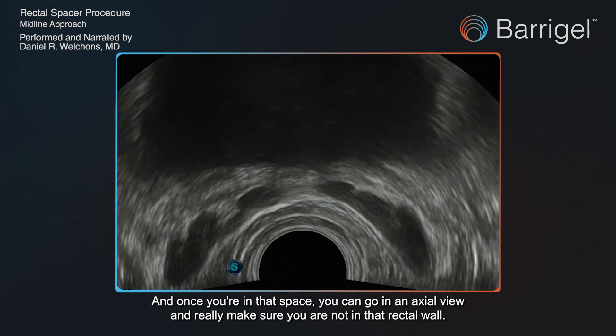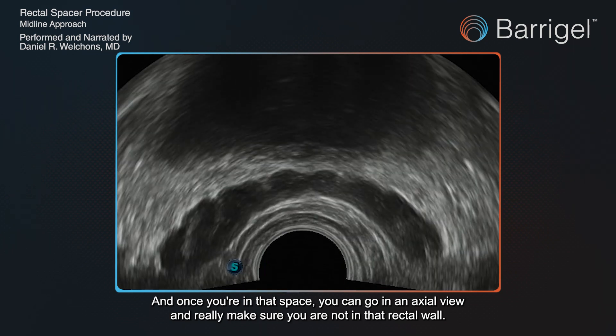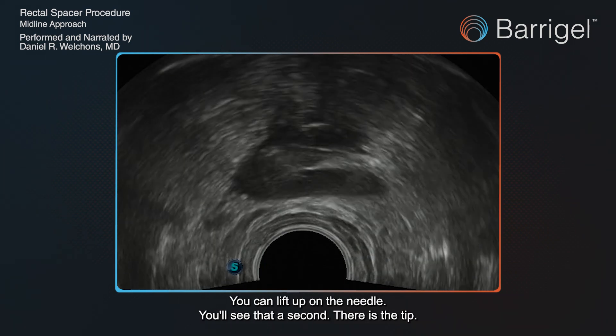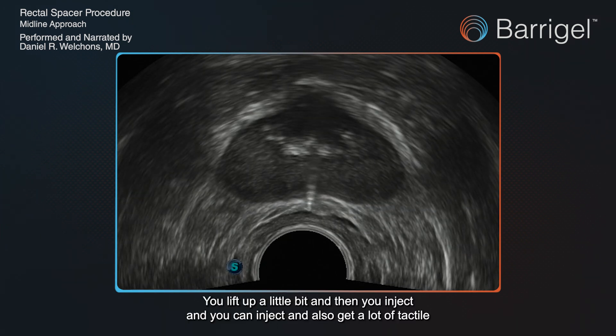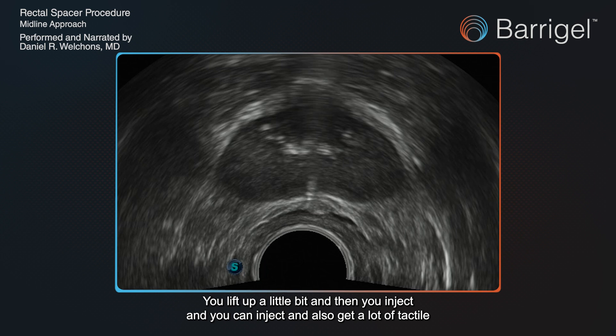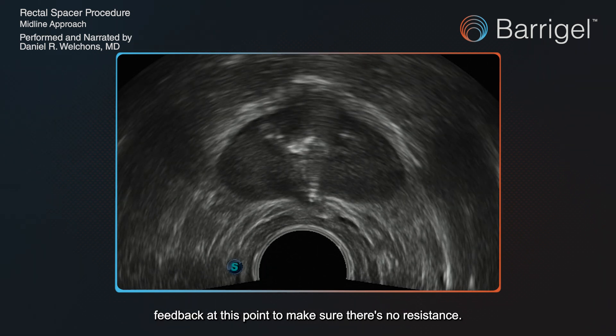Once you're in that space, you can go to an axial view and really make sure you are not in the rectal wall. You can lift up on the needle — you'll see that in a second. There's the tip. You lift up a little bit, then you inject, and you can get a lot of tactile feedback at this point to make sure there's no resistance.